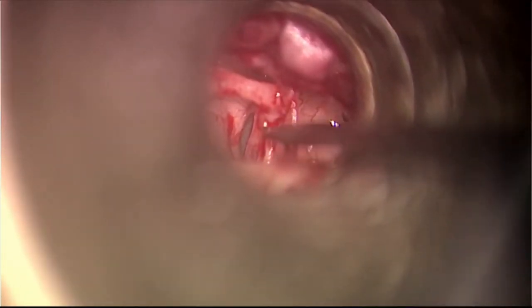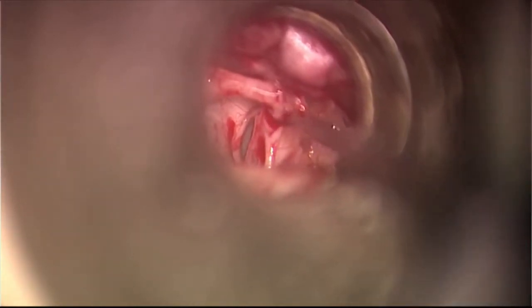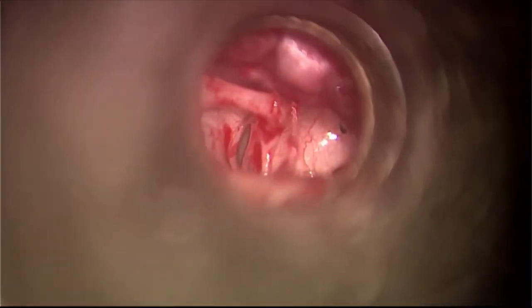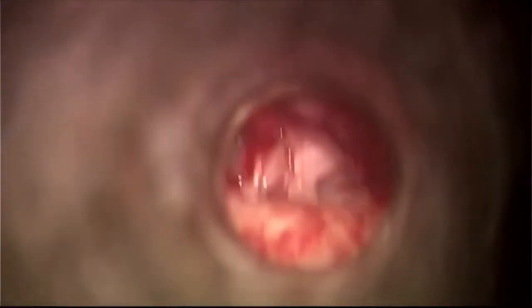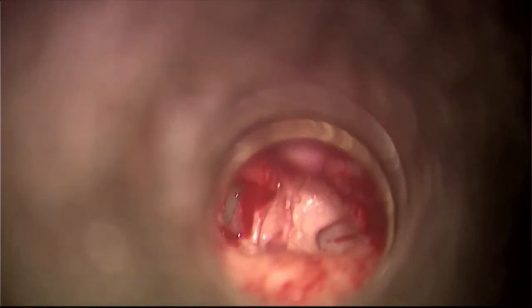Now see, this is the level of the incudostapedial joint. I am opening the joint here. Last case I had shown through the joint knife. This is with the pick. I have now opened the joint. A very important step that Satish has done is that he has opened it in the axis of the stapedius. It is not from left to right. It is in the axis of the stapedius, so that lateral movements do not dislocate the stapes. Anteroposterior movements can. Now, looking at the overcrowding here, I cannot do a reverse stapedotomy.